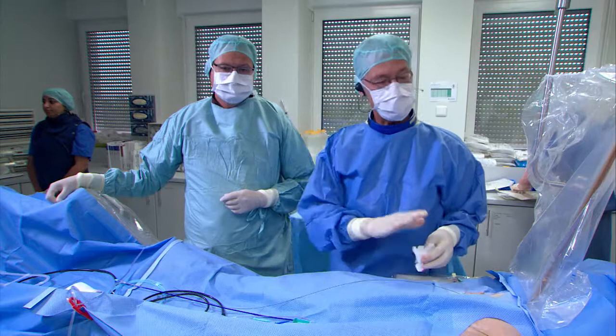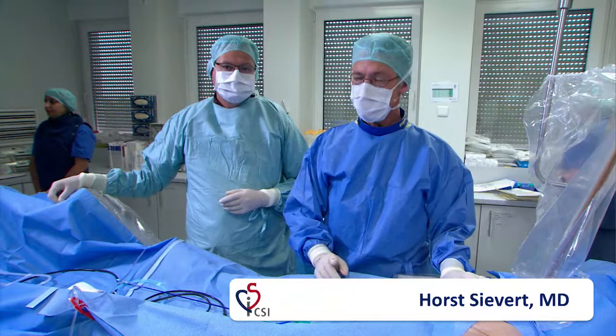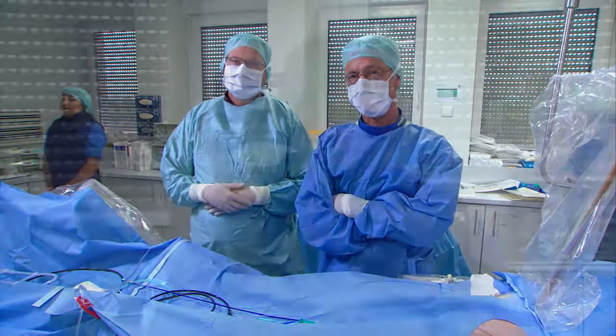Good morning, everybody, and welcome in Frankfurt. Very sorry for interrupting, but the TE probe is already in place, so that's why we wanted to go ahead with a live case. This is case number 10, and Swati is ready to give the case history. Swati, please go ahead.